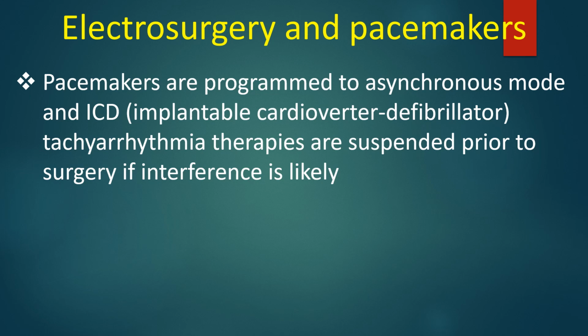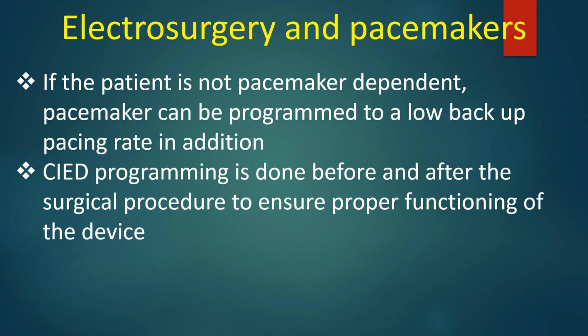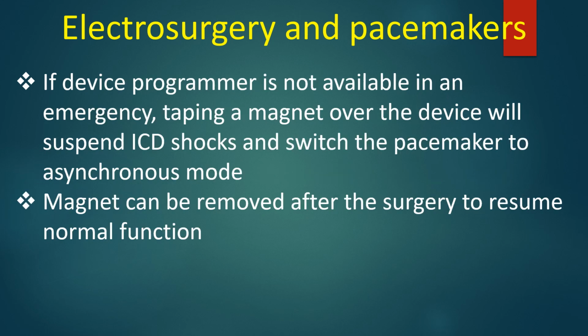Pacemakers are programmed to asynchronous mode, and implantable cardioverter defibrillator tachyarrhythmia therapies are suspended prior to surgery if interference is likely. If the patient is not pacemaker dependent, pacemaker can be programmed to a low backup pacing rate in addition. CIED programming is done before and after the surgical procedure to ensure proper functioning of the device. If device programmer is not available in an emergency, taping a magnet over the device will suspend ICD shocks and switch the pacemaker to asynchronous mode. Magnet can be removed after the surgery to resume normal function.